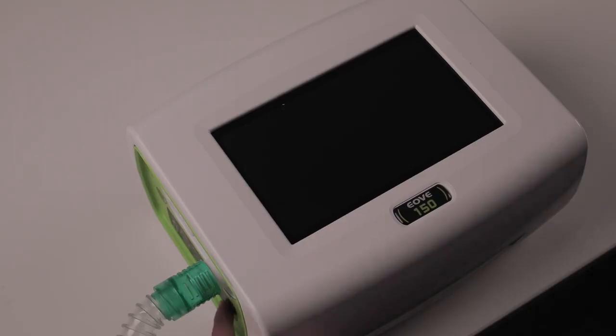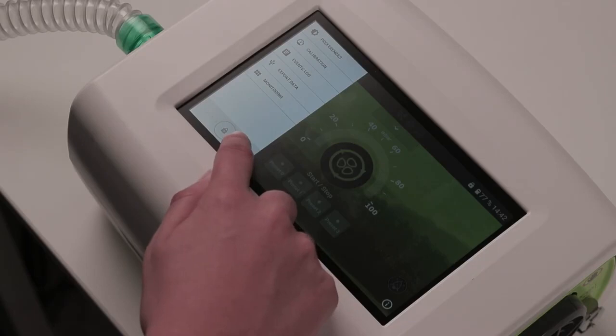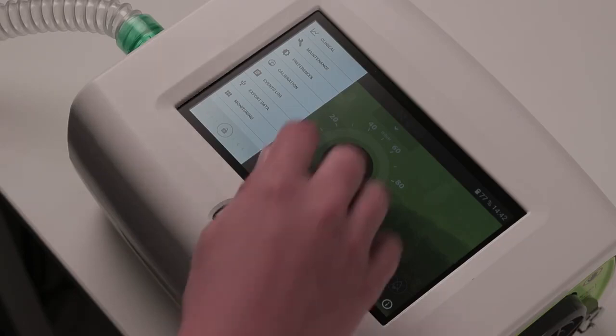To start the EO-150, push on the on-off button on the side of the device. To access the clinical menu, display the menu bar and hold the unlocking area at the bottom of the menu. Validate.